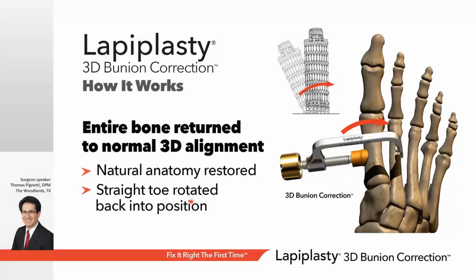Okay, so this device here is called a metatarsal positioner. What's happened first is we release all the tissues around this joint. That allows us to utilize this instrument to close down the angle and position the bone in the right position. This didn't come up in the presentation, but one of the beautiful things about this procedure is that the technique is designed to take a lot of the guesswork out.